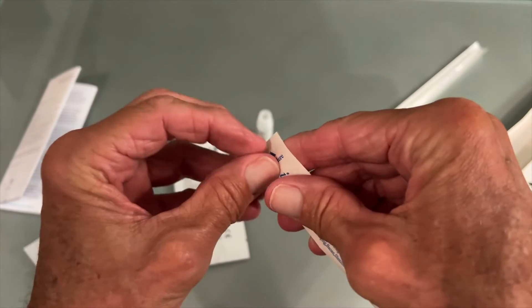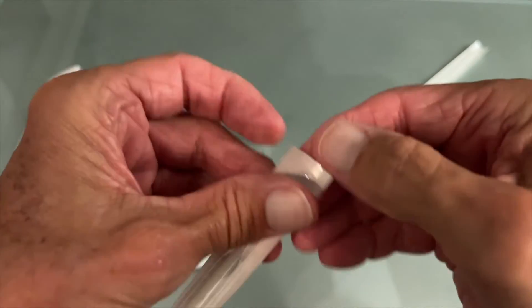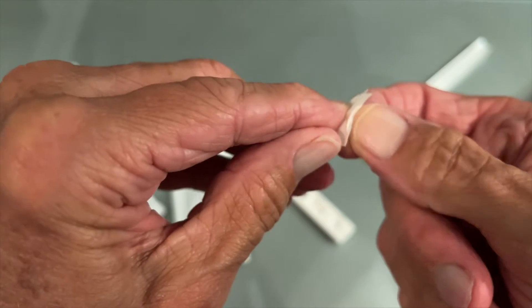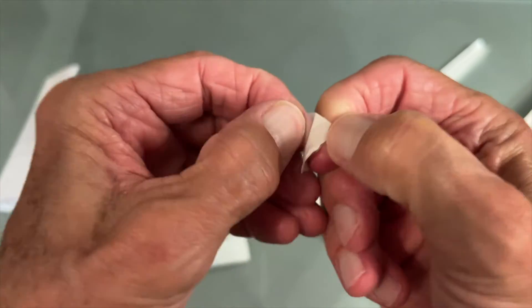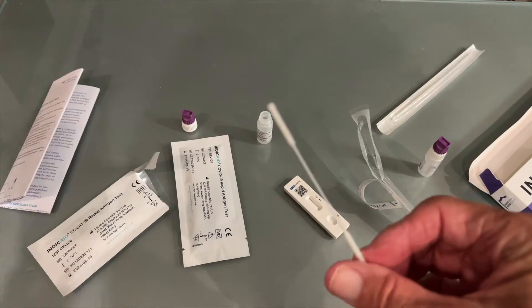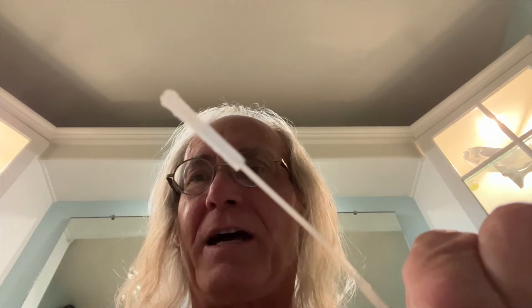I've got to open this up — it says 'peel here,' so let's see if we can do that. There we go, got the edge. Pop that baby open. This is the end you grab with your finger and that's the end you stick up your schnozzle. Let's go — get it up all the way in. Oh, that's pretty juicy. They want both sides.